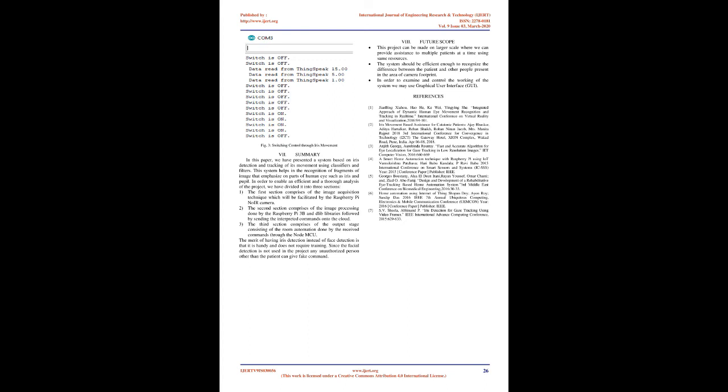B. Iris tracking. We have detected the face and the exact coordinates of the eye. The dlib in OpenCV will allow us to detect facial and eye coordinates. First, we have loaded the face detector and landmark predictor to detect the coordinates. Then we created a function in which we simplify and put the coordinates of 2 points that will return the medium location. All the frame capture will happen in real time. With the help of face landmark detector, we will get different specific index positions from which we will extract the location of both left and right.